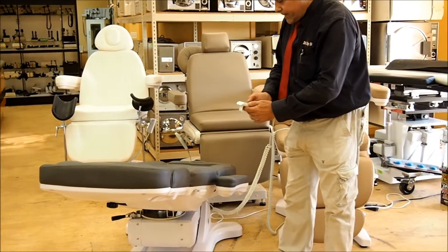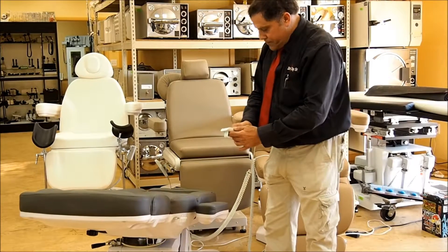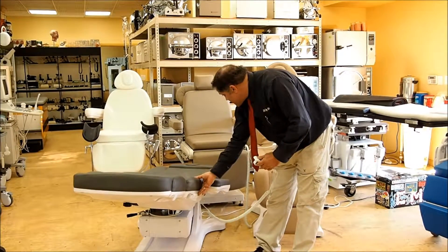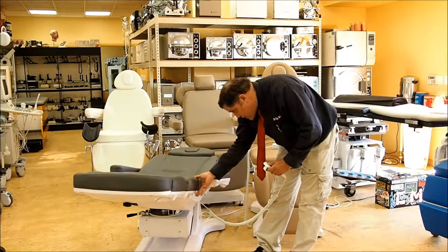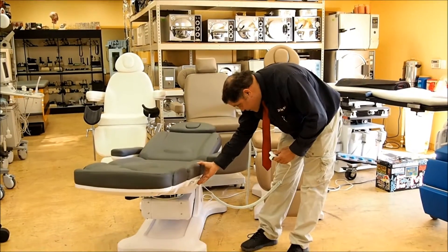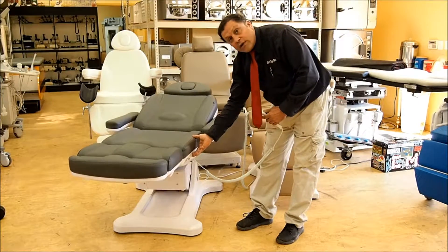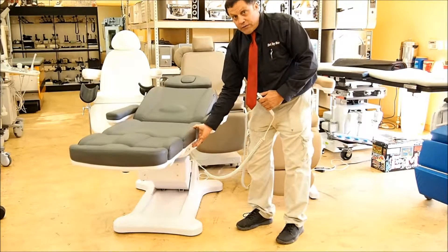Let me go ahead and put this in the up position. Bring it back up a little bit — I'm going to raise the table. This one also has swivel, which is just a great feature. You'll see this goes a little bit higher than all the other ones previously. It's screw-driven, which means there's no hydraulics.